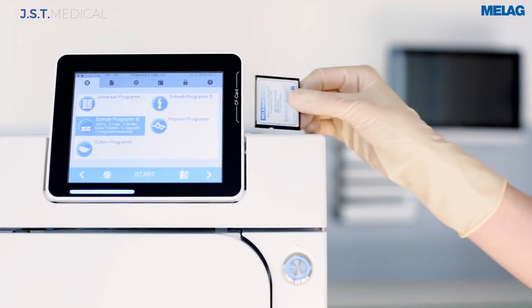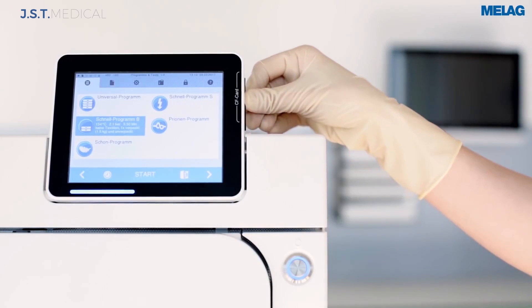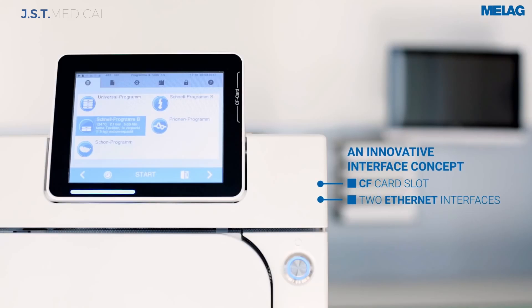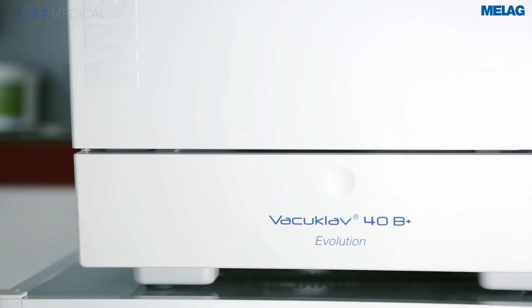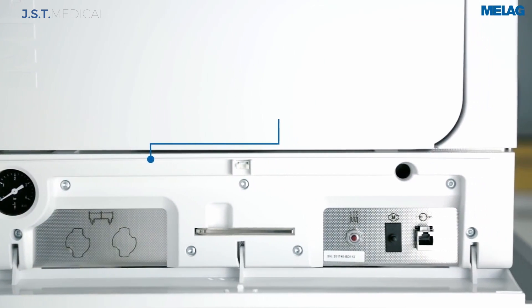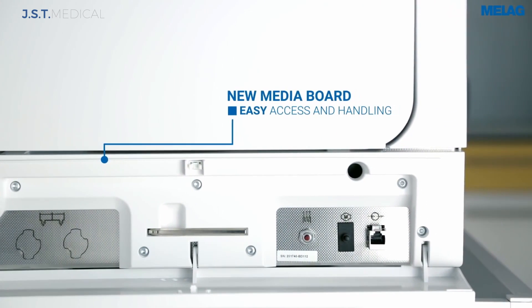Every cycle is automatically saved on the integrated CF card. The autoclave can be connected through the built-in data port to your network and have files automatically saved to a specific computer. The front has an easy-access service panel.